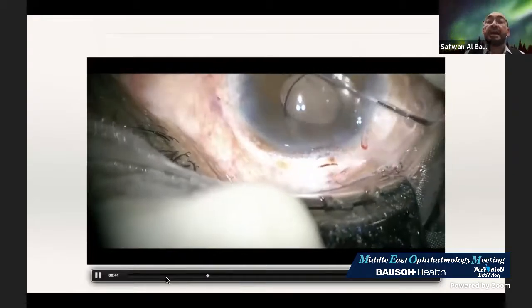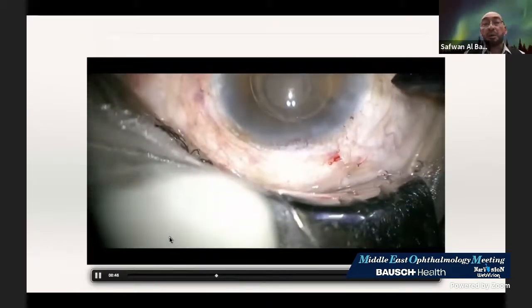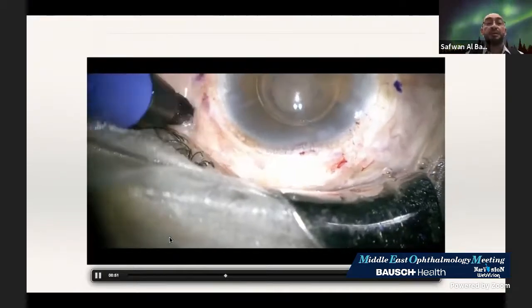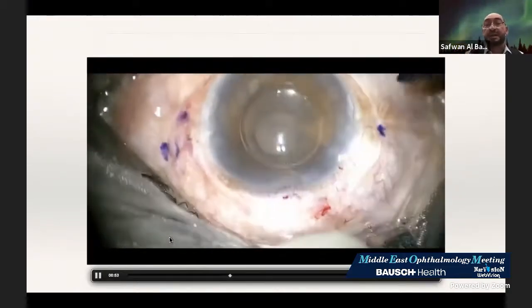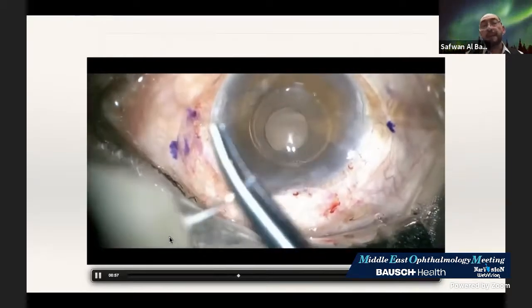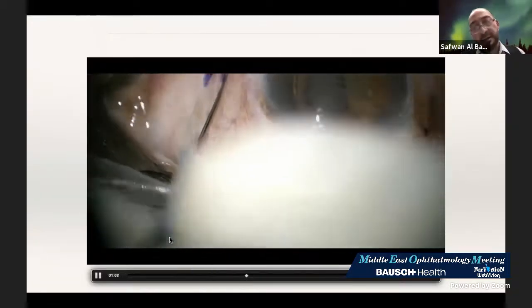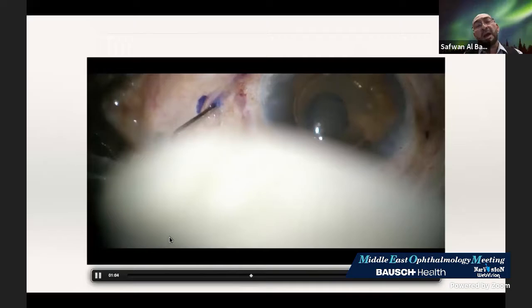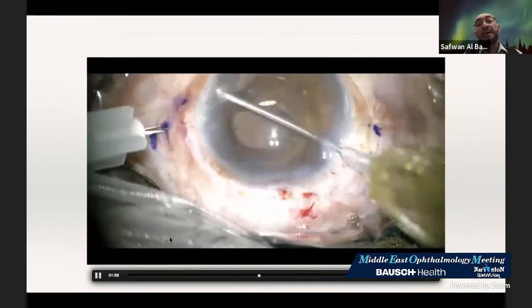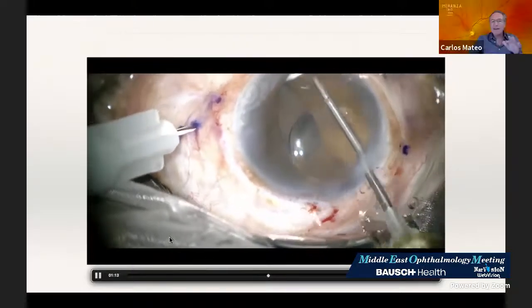The leading haptics was up. The marker was 2 millimeters. See, here 2 millimeter, and then 2 millimeter. So I used 2 by 2, but it wasn't clear. Unfortunately, the camera was in the center. Here I used 9, not 9 and around 10, or sorry, 11. No, I used 9 for both. And I used the old technique, the leading haptics first.